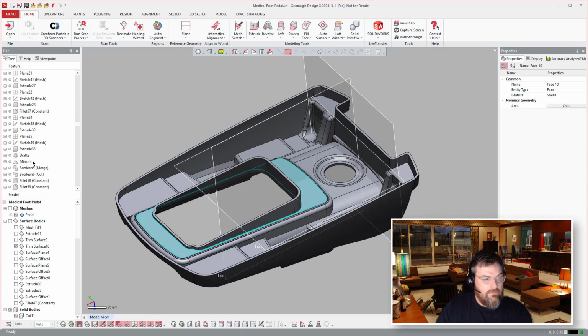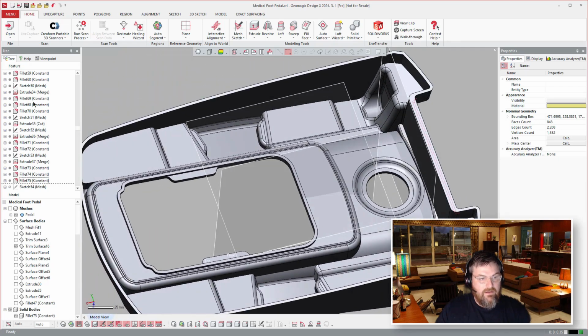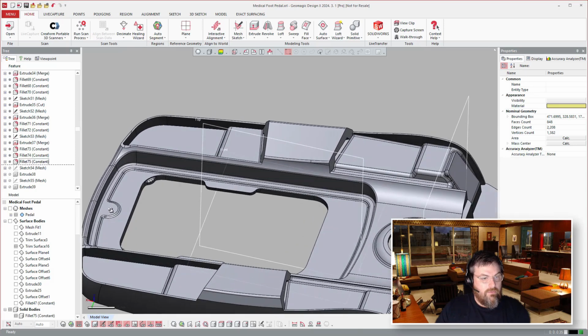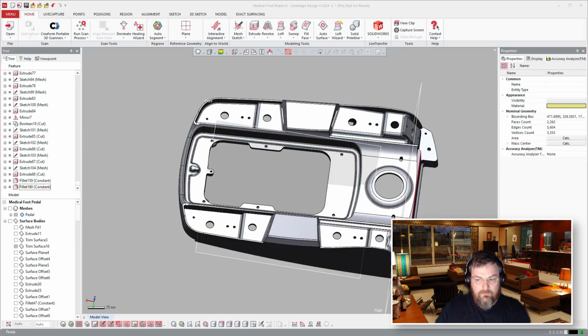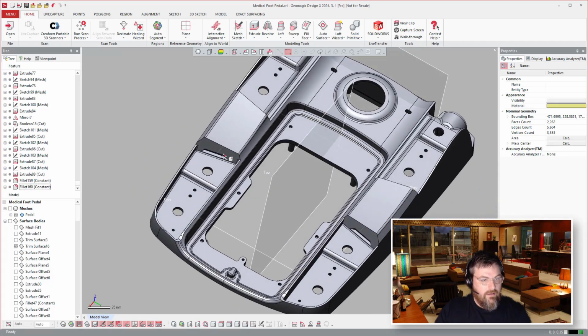And then we'll just skip way down here. So you see there, we got the fillets all applied there. A lot of dress work here. Oh, we went ahead and added this here. If you click on that, and we're almost done. So I'll just roll to the end here. So now, let's roll to the end here.